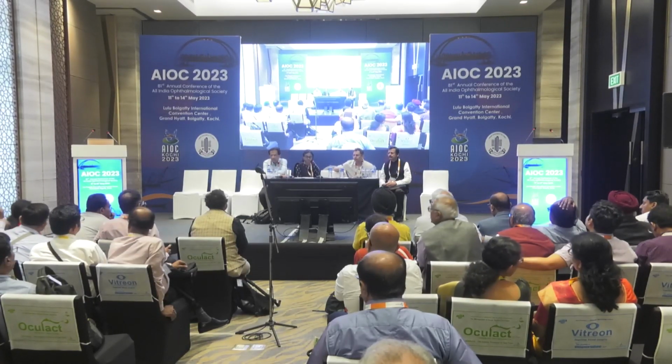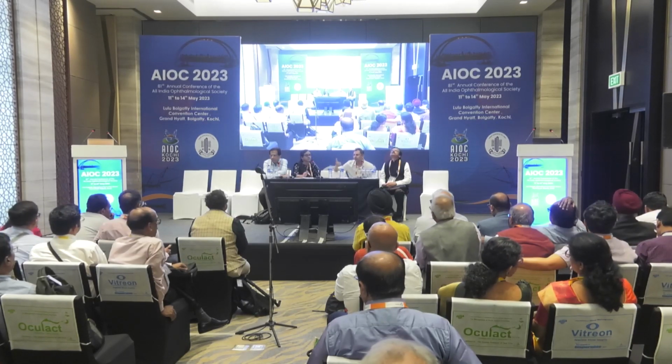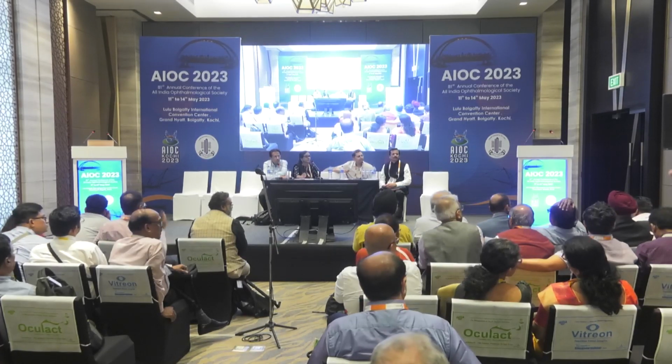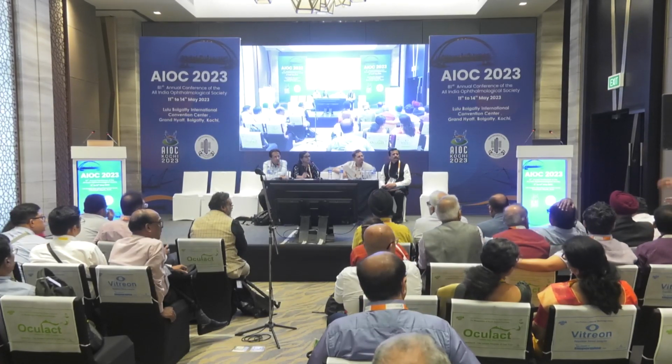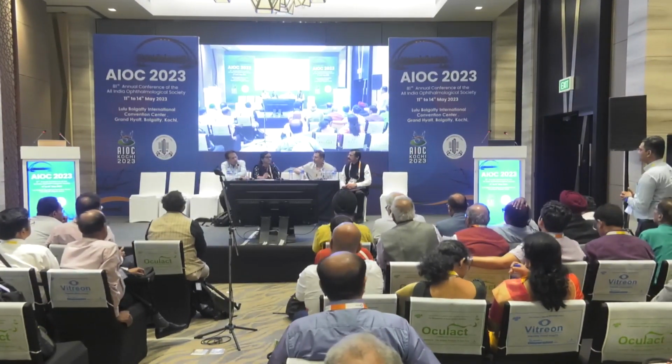Yes, sir. Center of the globe. Always center of the globe. Just like intravitreal injection, you must have given intravitreal in the same way. Is there any chance of the triamcinolone which is cleared after vitrectomy remaining? There is. It will be there, but it's not going to cause any problem.